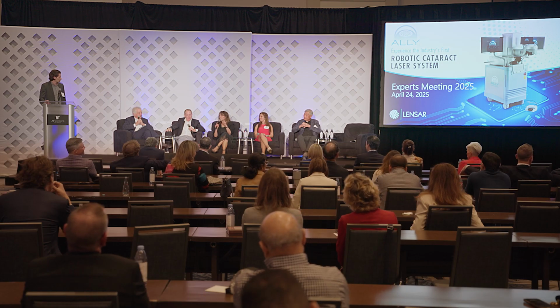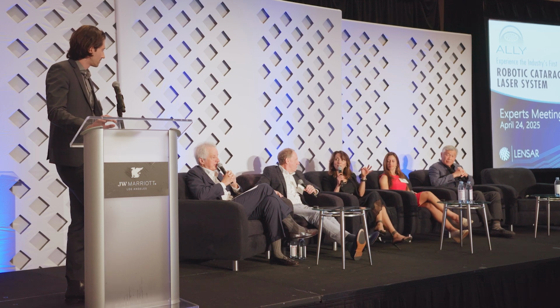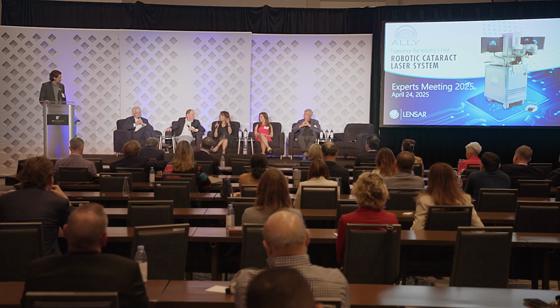I appreciate that you did just the capsulotomy with the laser and not fragmentations, because the pressure and the air can really tear that posterior. And I also like to go smaller with the capsulotomy so that it allows me to do an optic capture or a sulcus lens with an optic capture. So that was a great case.